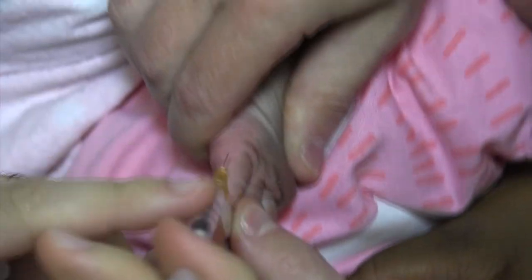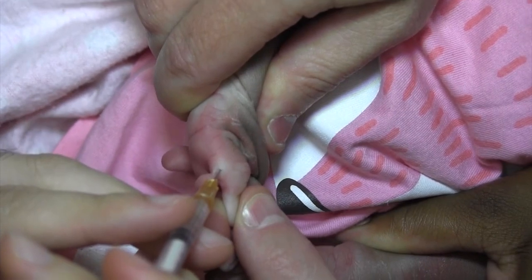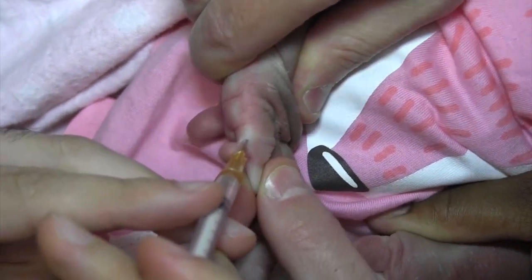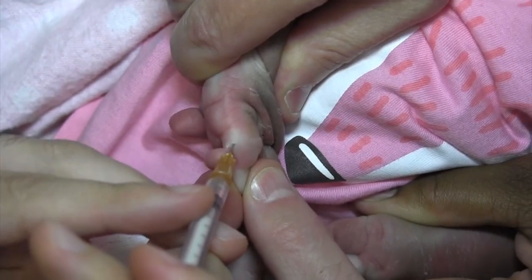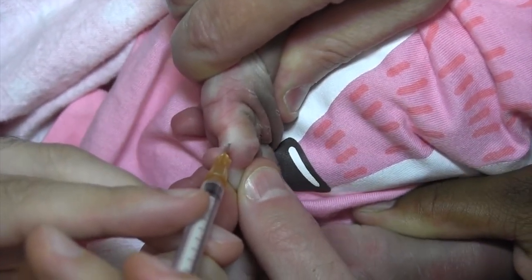The technique begins by injecting Marcaine with epinephrine using a small gauge needle — in this case a 27-gauge needle and a TB syringe — into the base of the stalk. After allowing the anesthetic to take effect for 15 to 20 minutes, the rest of the procedure is painless.